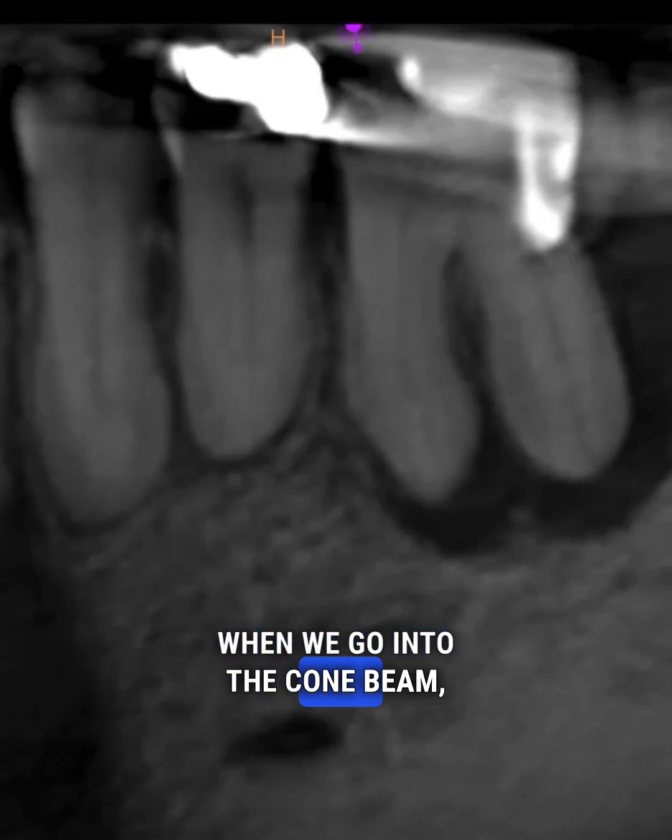When we go into the cone beam, again, you can see quite a bit of bone loss. Now, here is the mesial root in the coronal direction. There is a clear mesiobuccal and mesiolingual canal. They do join and create a common canal apically. Now, I want to be very clear. I could not find that mesiobuccal canal.